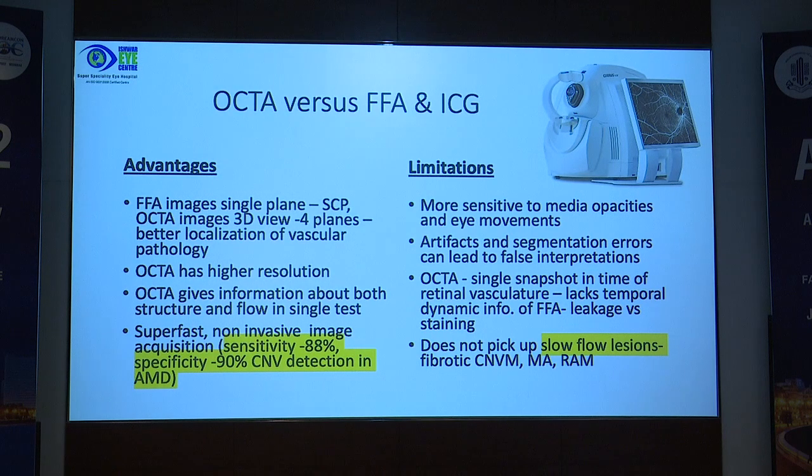Limitations: it is more sensitive to media opacities and more sensitive to eye movement, like sir just showed. Artifacts and segmentation errors can spoil your diagnosis and confuse you. And it is a single snapshot in time of the retinal vasculature. There is no continued study, like angiography, which continues for 10 minutes, so you do get temporal information there.